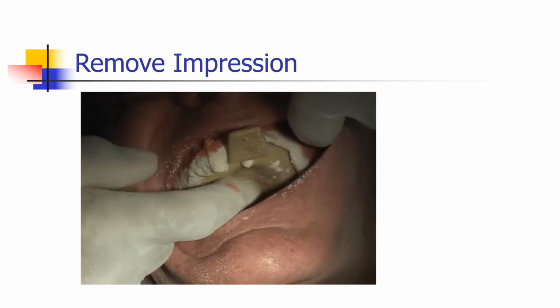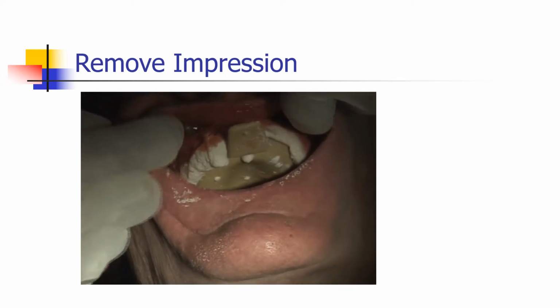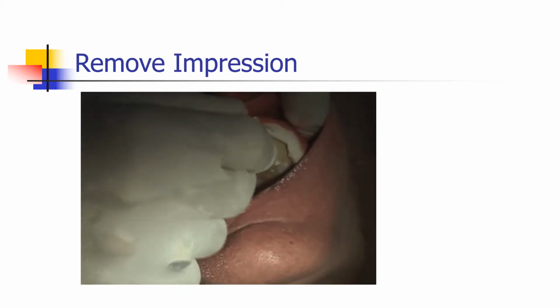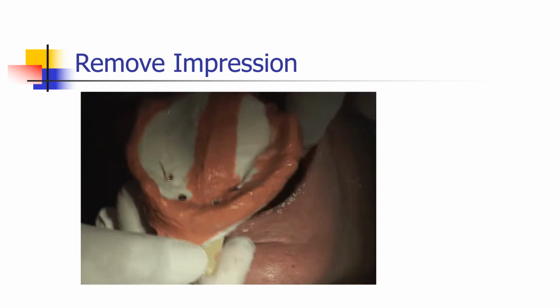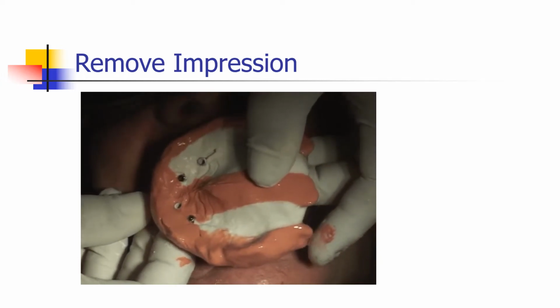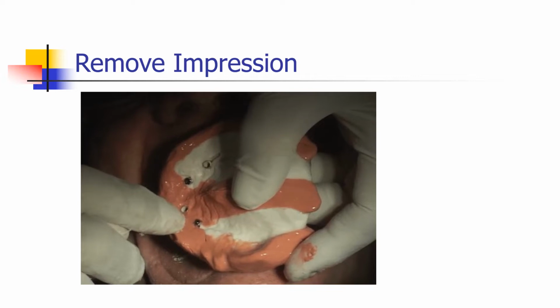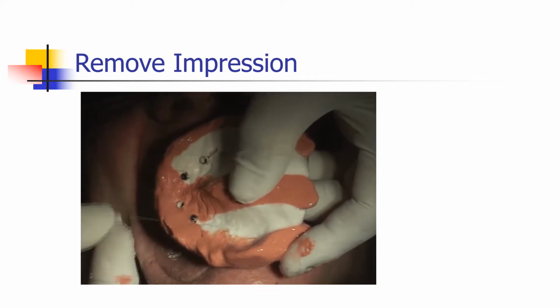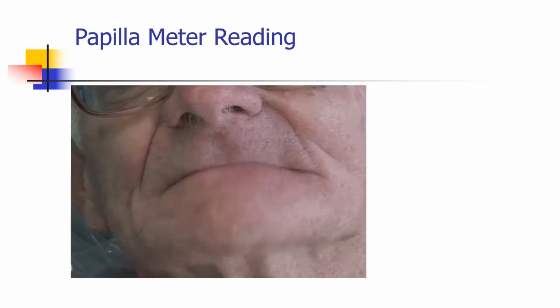To remove this material, don't use the handle as a handle, but just take your fingers up under here and then just kind of work it out until you hear the suction release. And as soon as the suction releases, then it comes out. And see, the bar came out with the impression. And before we pour up the impression, we're going to take out the alginate material right under the bar. And then we're going to take the bar out and pour this up without the bar.